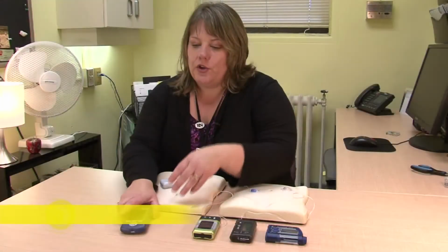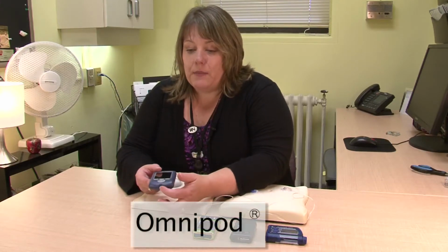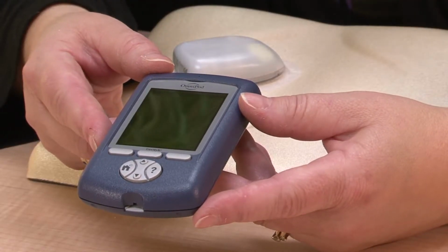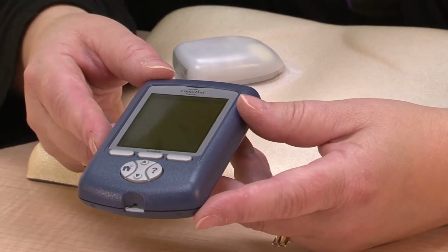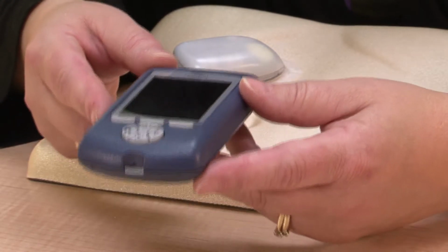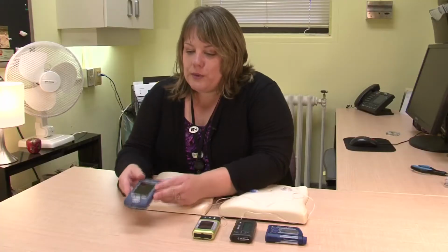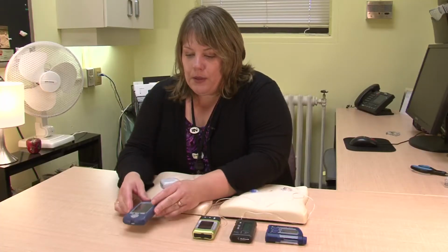The first pump that I'll show you is one called the Omnipod. It's a pump that doesn't have a tubing. So this is a remote control. It happens to be the patient's blood glucose testing machine as well. But this is what the person would use to deliver their insulin. Important for you to know, this doesn't have to be attached to the patient. So this could be in someone's purse, it could be in their knapsack, it could be in a number of different places. So this is the actual pump.